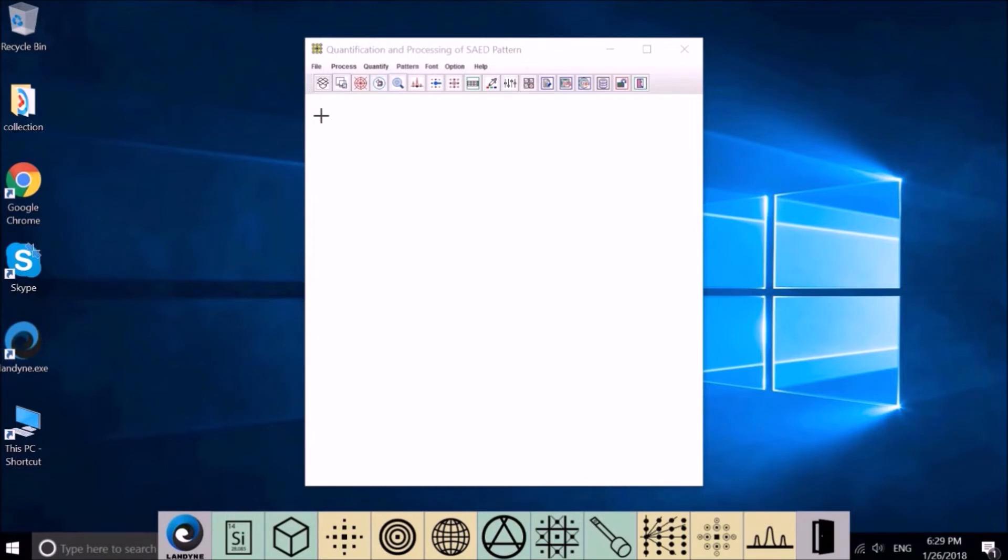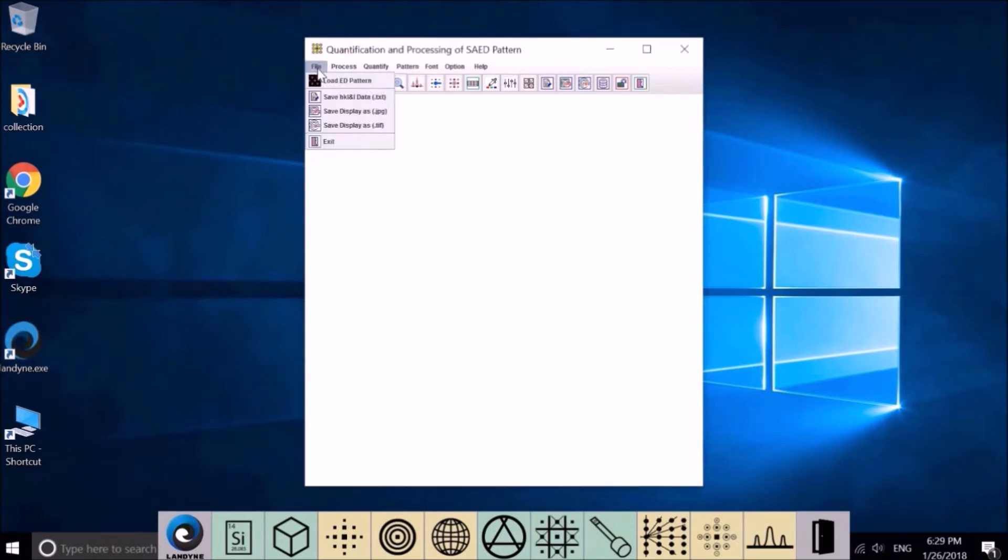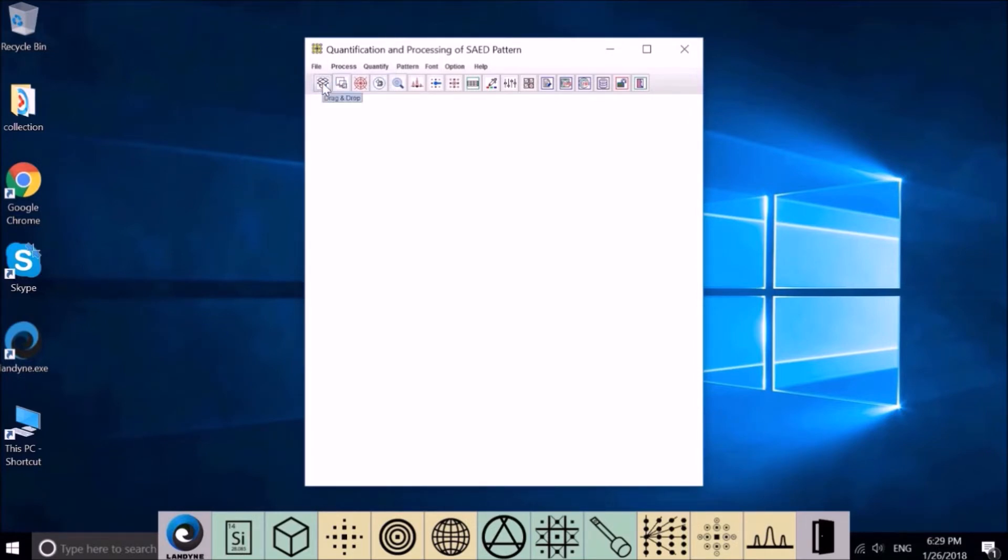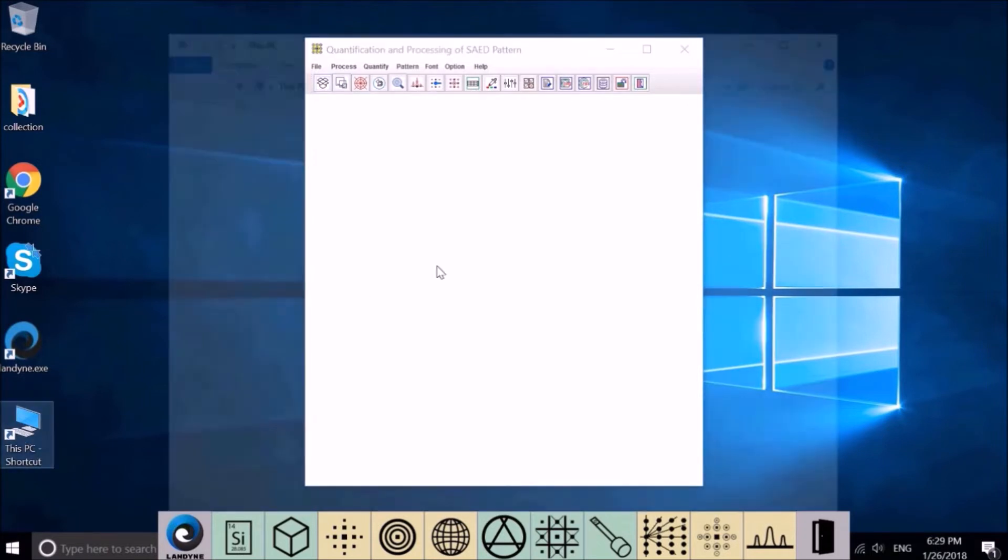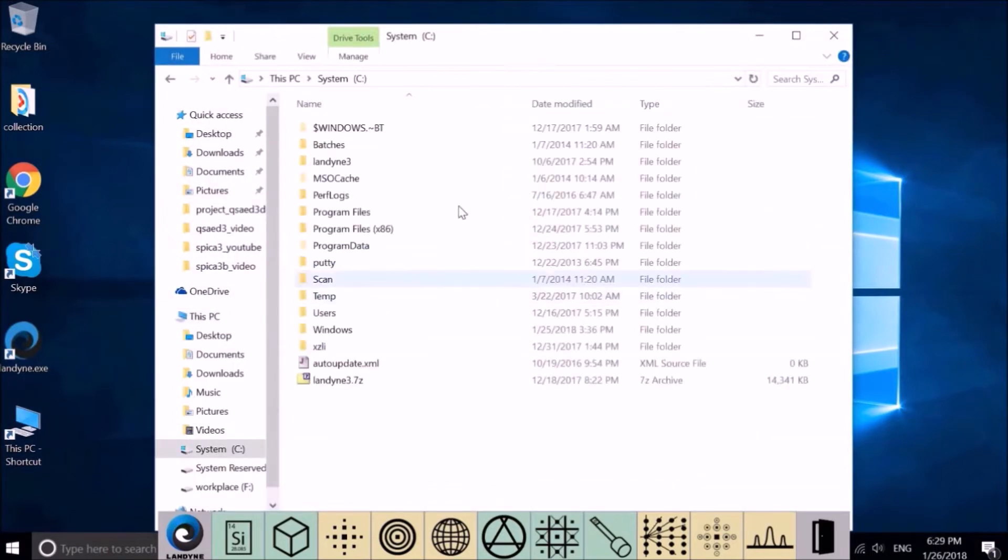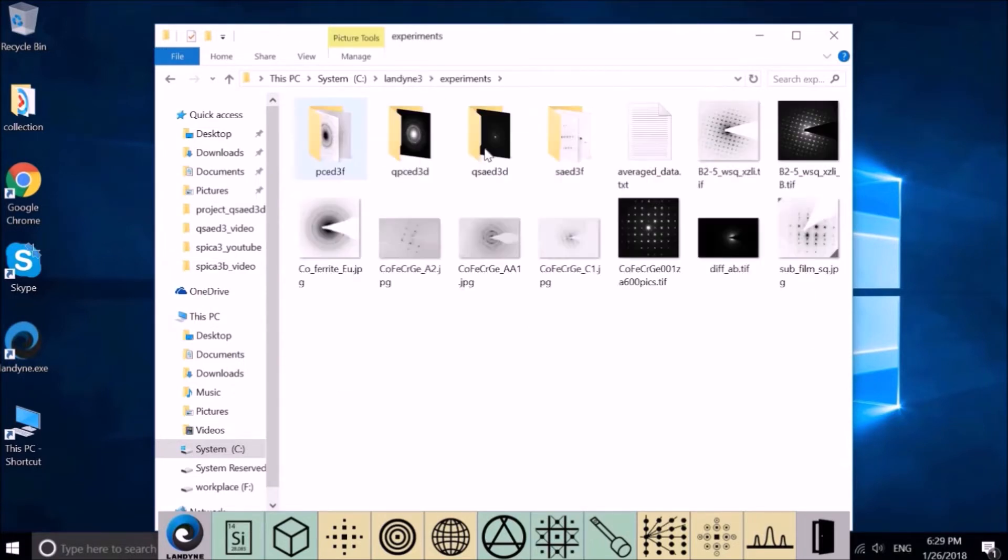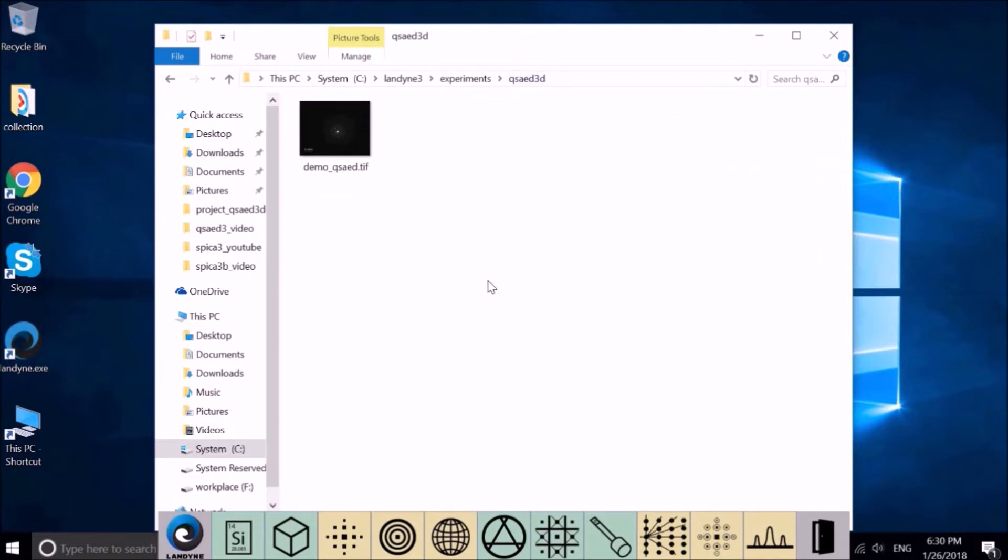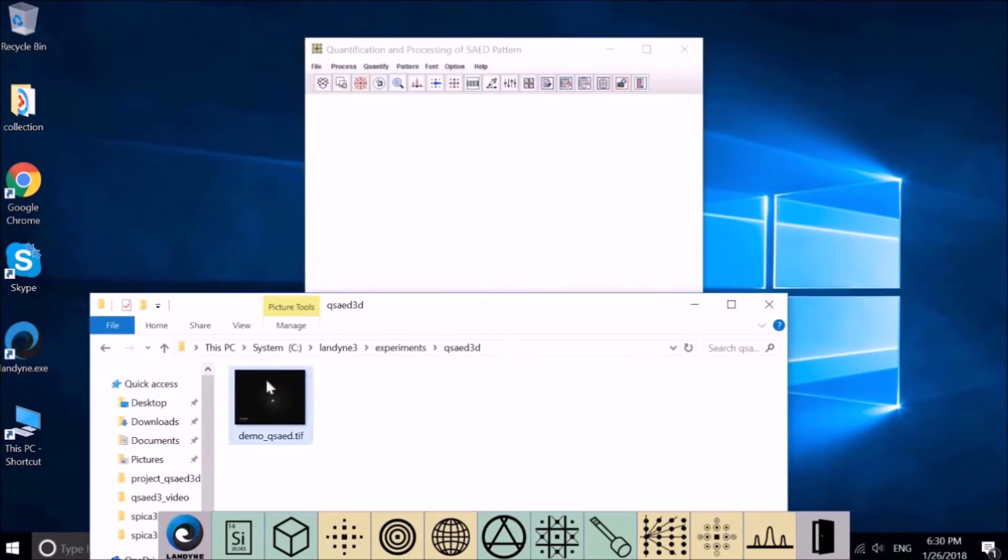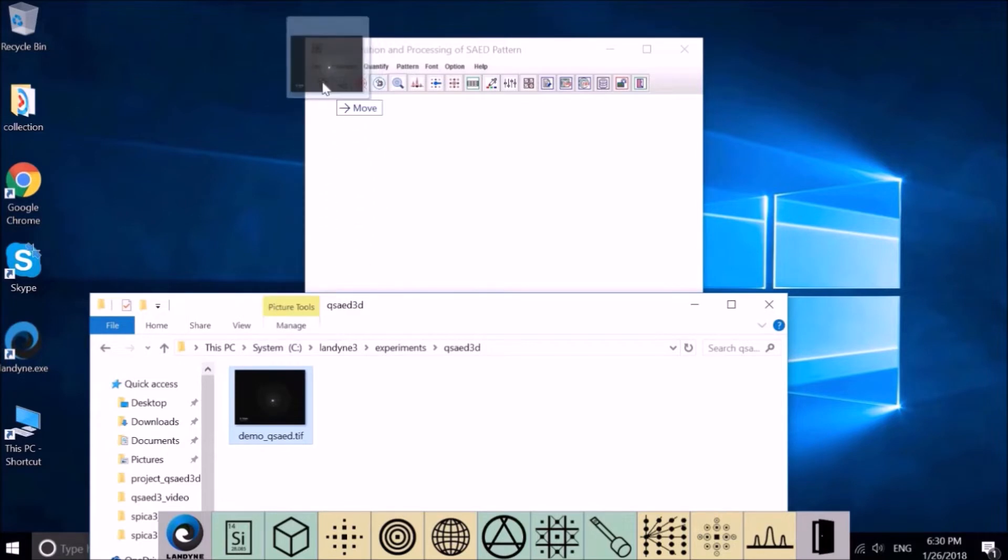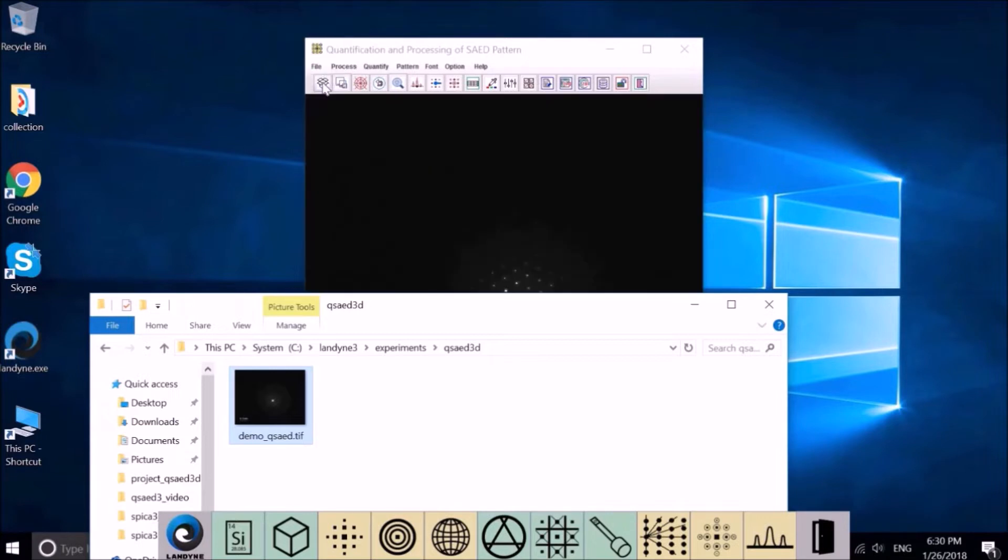There are two ways to load image in QSAED. First, use standard Windows file system. The second way is to find the image and drag and drop to this dropbox. Go to C folder, landyne3, Experiment, QSAED3D, Sample. This image - click your mouse left button and drag here, and see it move. Release it.